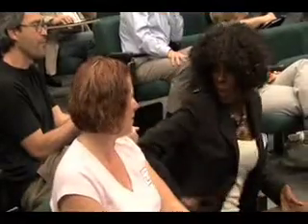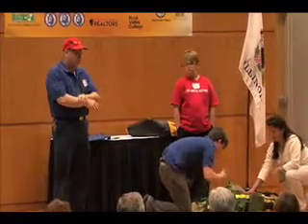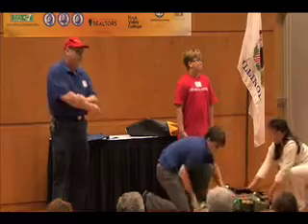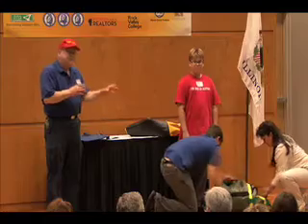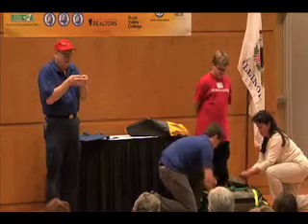You're using a vacuum pump versus pumping it up full of air. Is there a difference between those methods? Yes, absolutely. With the old-fashioned air splints, you put pressure on the limb, and this is contraindicated. In Europe, we don't use air splints anymore because it's dangerous. It puts pressure on the nerves and circulation tissue. This is vacuum, which is no pressure at all. It's just supporting because the beads inside are doing their job, pressing together.